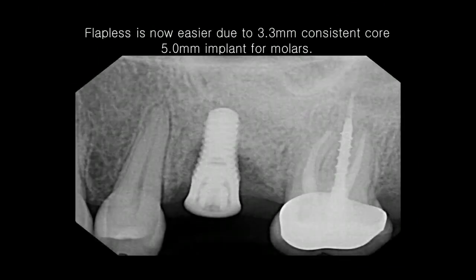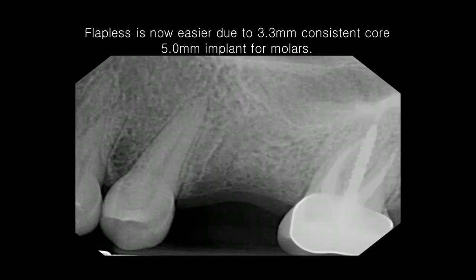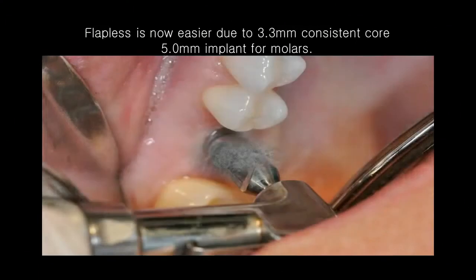Now here's a case. Here's an implant that failed. It's a Straumann tapered effect that failed. So this is it grafted and healed over. And we had minimal surface area to the sinus. So this patient didn't want a sinus lift. So here we're doing a flapless technique. I don't always condone flapless techniques, but here we're going to show one.